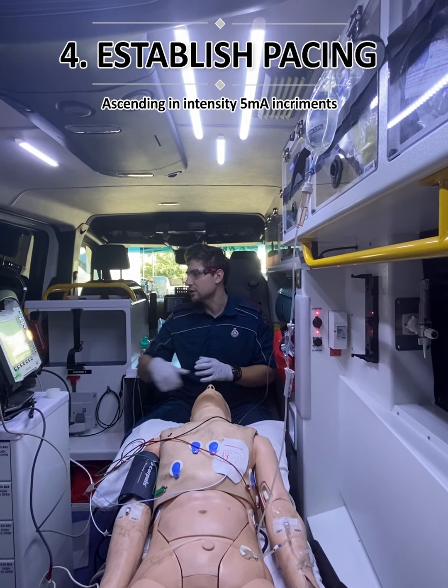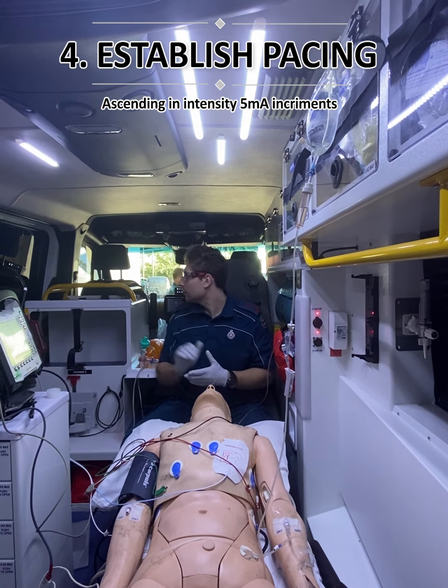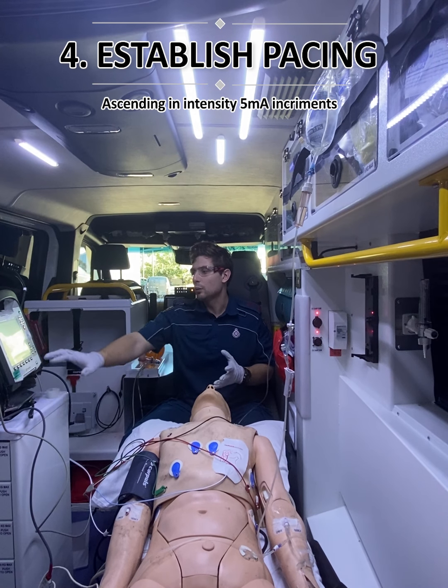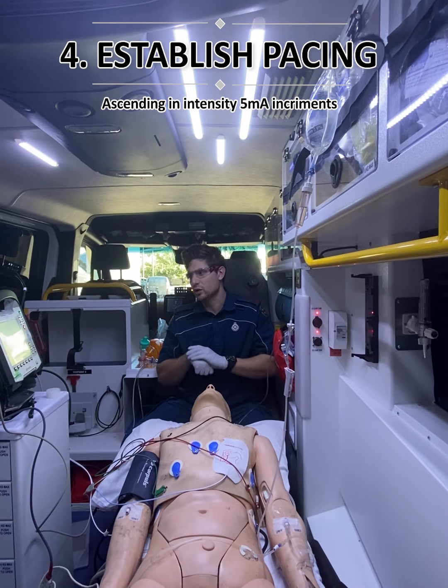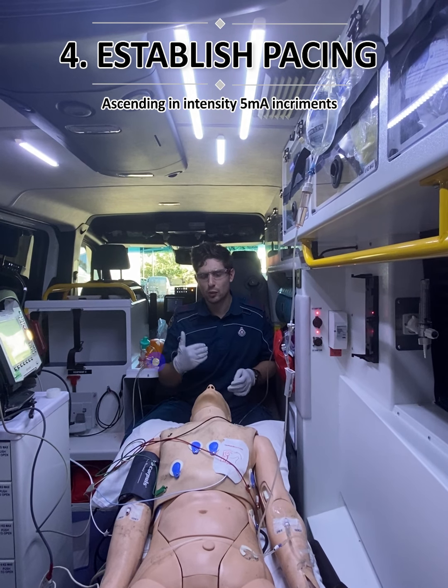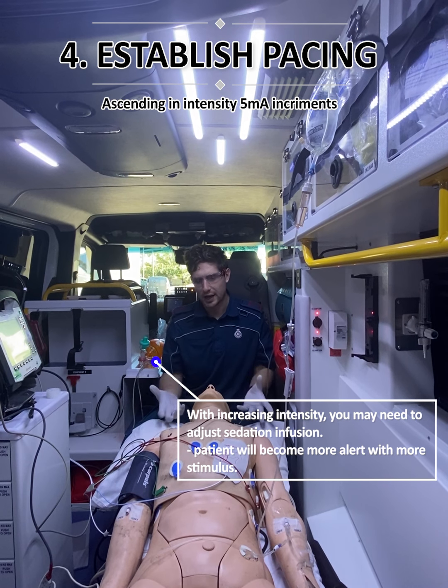Assuming we have met our goals for adequate sedation, or the patient has become so compromised that we believe we need to move to pacing straight away, let's move to the procedure itself. As far as our procedure is concerned, we'll go to the pacer, placement in situ, and we have these 3 modes that we talked about previously with intensity, frequency, and mode. We're obviously using demand mode, as we talked about, and with our intensity, we're going to work our way up. Because this is a conscious patient that we're going to procedurally sedate, we'll work our way up.